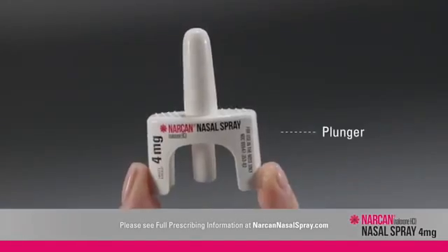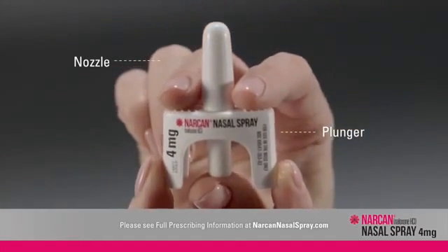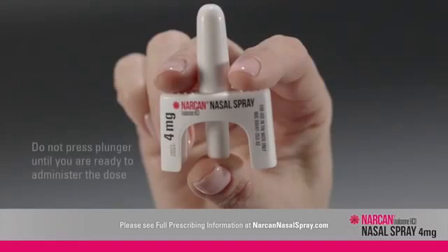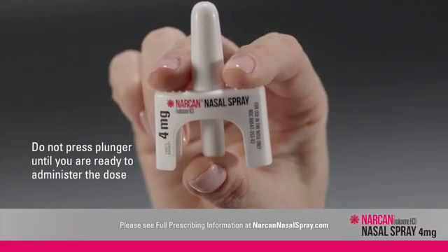Hold the NARCAN nasal spray with your thumb on the bottom of the plunger and your first and middle fingers on either side of the nozzle. Do not press the plunger to test or prime the device. If you do, you will waste all or part of the dose of medication.